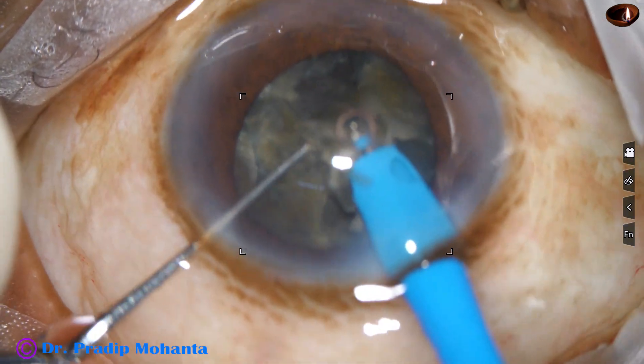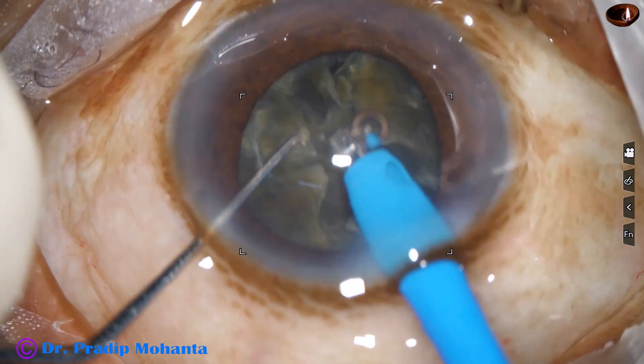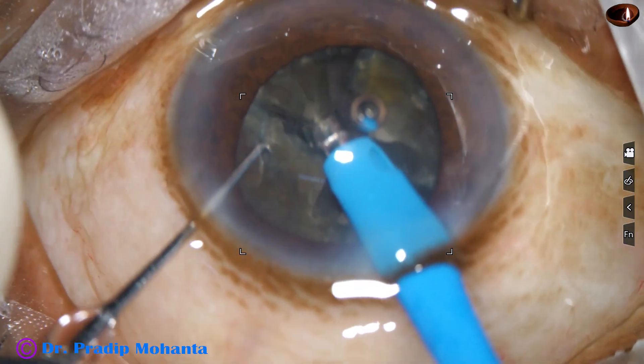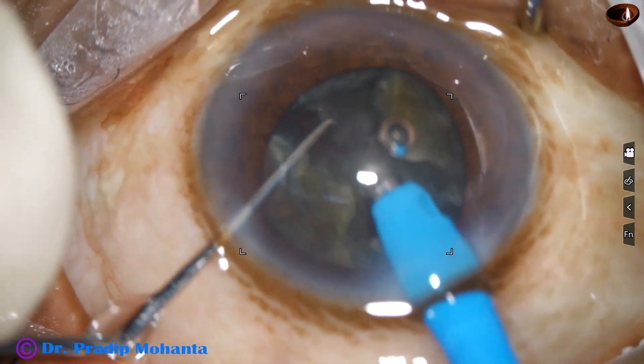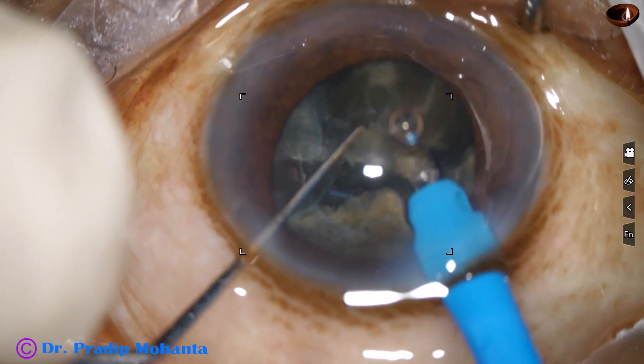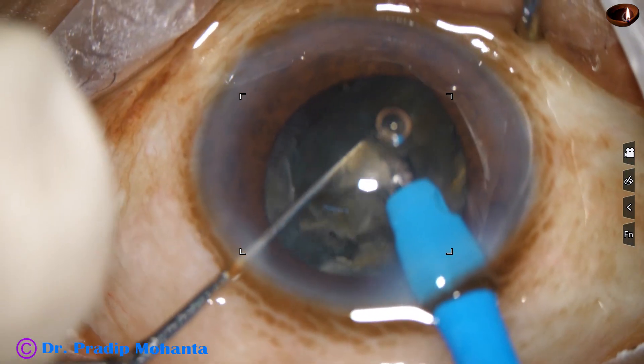The ultrasonic energy being used is 80 percent in continuous mode. Flow rate is 45 ml per minute. Vacuum is 450 millimeters of mercury.